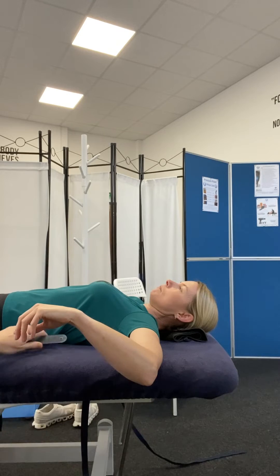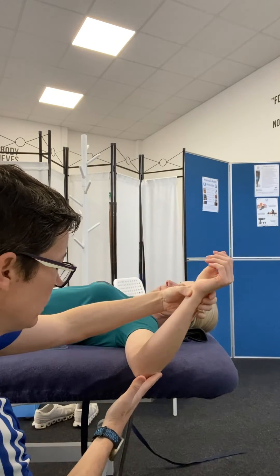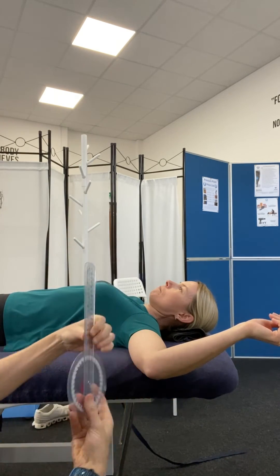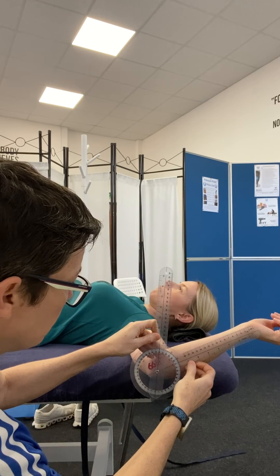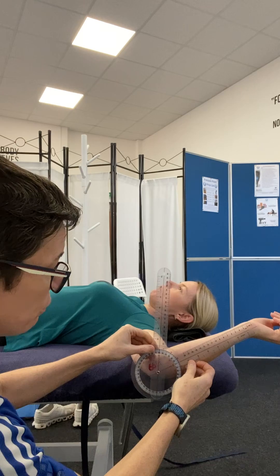Lateral rotation is the same. Starting position here, let the arm drop backwards until it comes to the natural end, and then we should be able to release that, get the goniometer, pivot point through the olecranon process, and the other arm goes up to the ulnar styloid again. So for lateral rotation here, we've got 60 degrees.